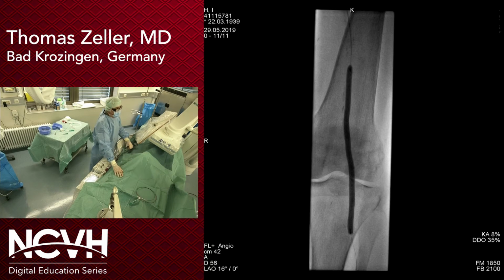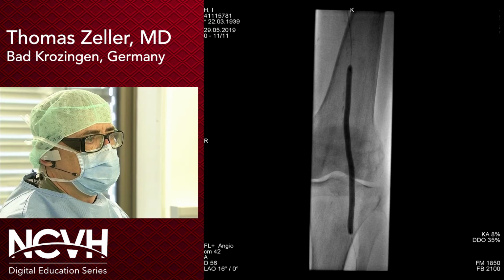This is Larry Diaz, Dr. Zeller. In my hospital, the legal team has advised to withhold the use of drug-eluting technologies for the time being until the panel reconvenes at the end of June. But I would argue that in this space, we're across the joint. DCB is designed specifically for this type of space. I mean, ideally, you would want to avoid putting a scaffold across the knee.